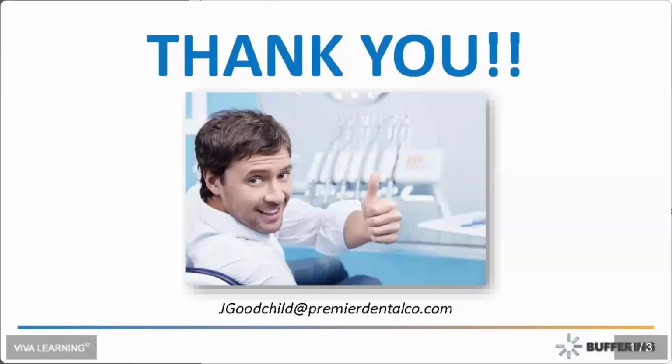Any patient contraindications? Nope. Buffering is just making what you're already doing work better for you, providing those three benefits of less injection pain, quicker onset, and better effectiveness overall. As soon as you buffer it, you do need to use it. So the question is, how soon after you buffer do you have to use it? I would use it right away. Like I said, rip open that foil package, buffer, and use immediately.